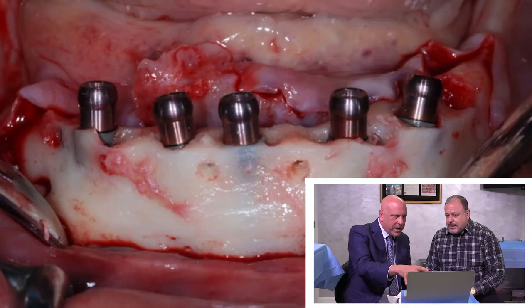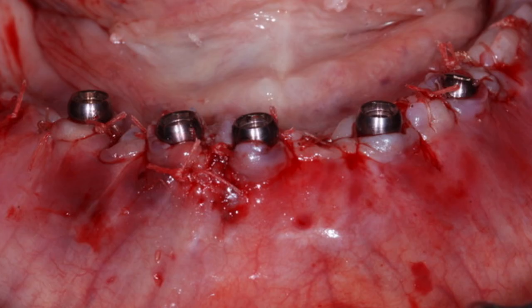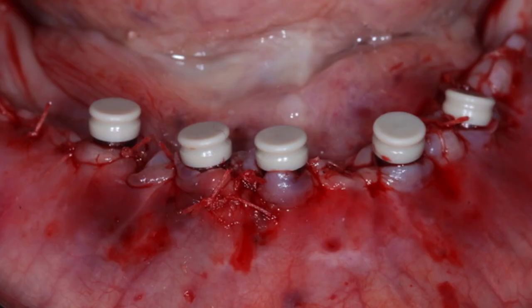So these pinkish abutments that are on there, those are the FTX attachments that have been screwed down into place. So now we've got our closure through a couple of different techniques, and we've got good tissue height to the abutment levels of where we're picking up. And now we're going to start our prosthetic phase. These are spacers that we're just putting over the abutments to be able to pick up into the denture, so we know where they're at in the denture.